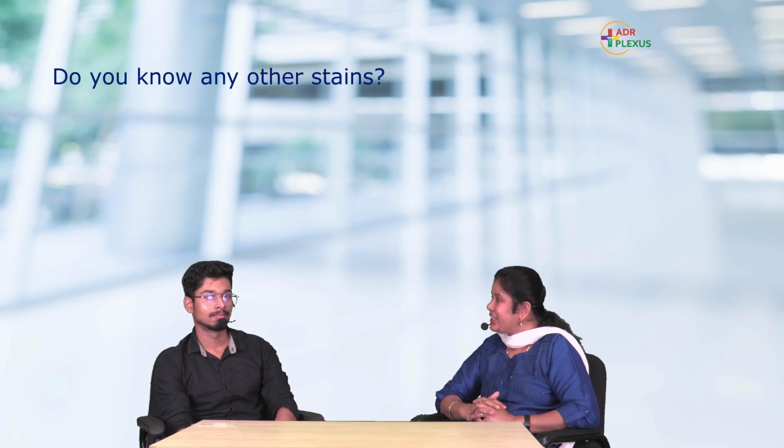Now comes the star question. Any other stain that you can use for doing this DLC? Wright stain, Field stain, Giemsa stain. Yes, excellent. So you are a star student. Okay, fine. So now comes the procedure.